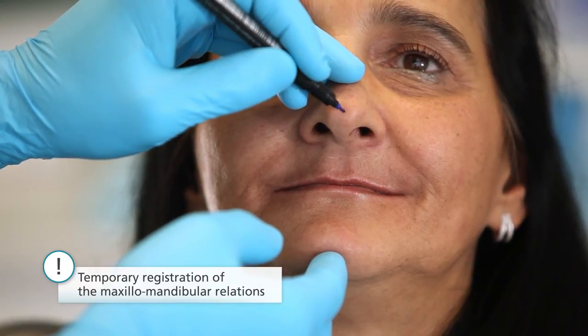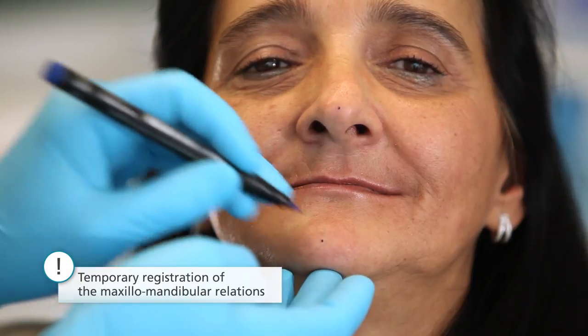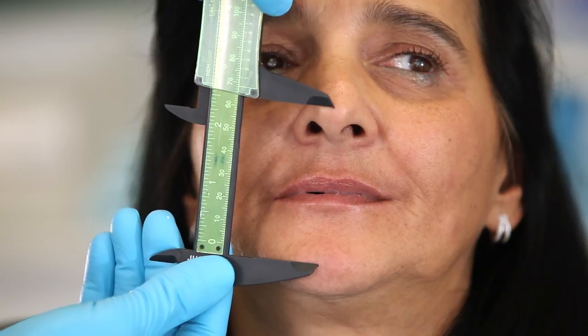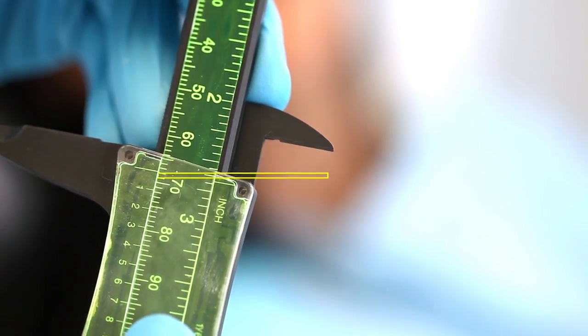Next, make a mark on the nose and on the chin of the patient to determine the maxillomandibular relationship. Ask the patient to wet her lips with her tongue, then close them in a relaxed position and breathe out softly a few times. Measure the distance between the markings and adjust the calipers accordingly. You have now determined the physiological resting position.